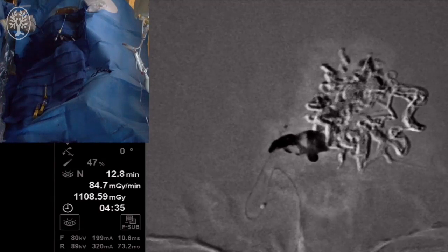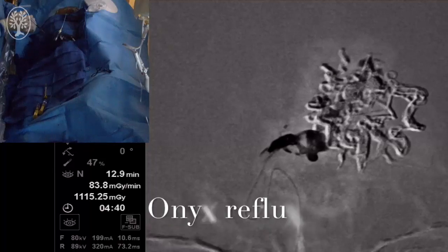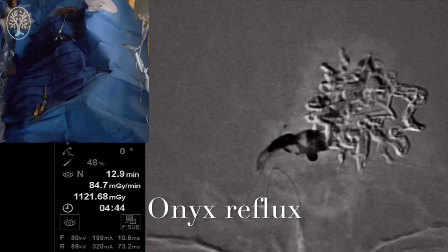Again, we see more filling, and there's no filling right now into the venous phase, but we are starting to get some Onyx reflux. So we pause the injection to see if after the reflux we can then get forward flow of the Onyx.